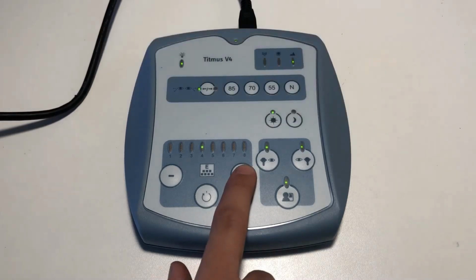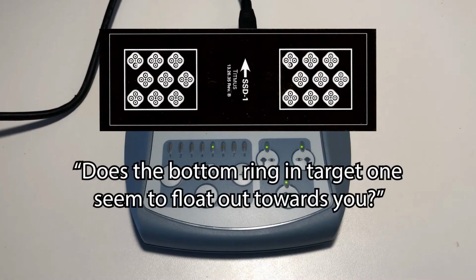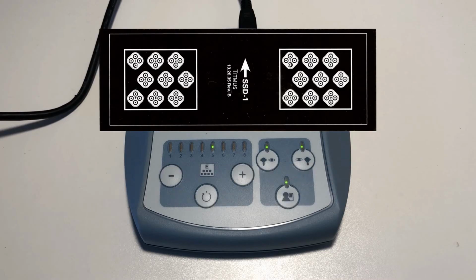Advance to slide number 5. This slide tests for depth perception. When the patient sees the combined image, one of the rings in each target should seem to float. Ask the patient, does the bottom ring in target 1 seem to float out towards you? If no, move on to slide number 6.